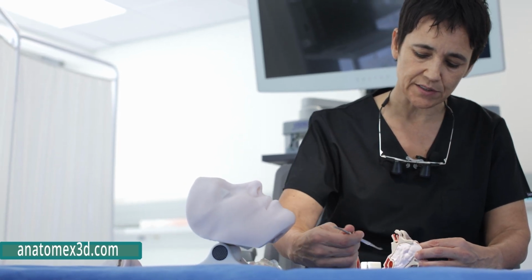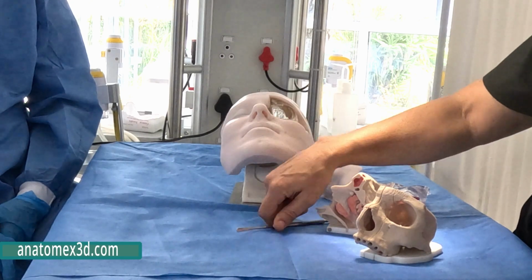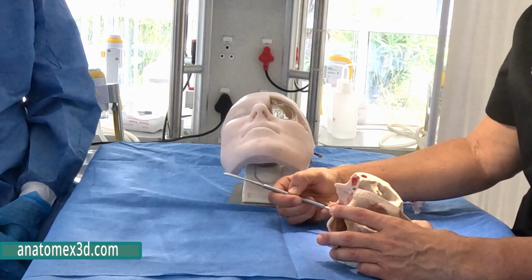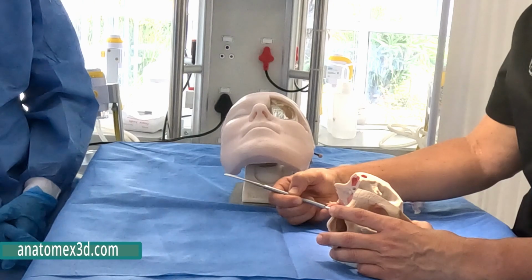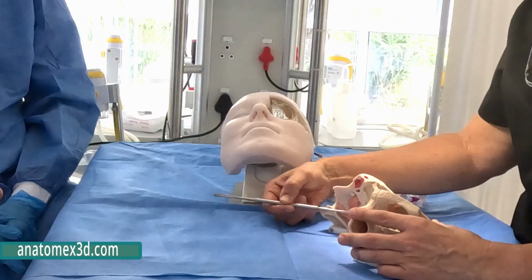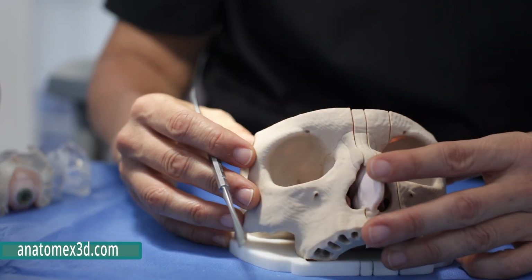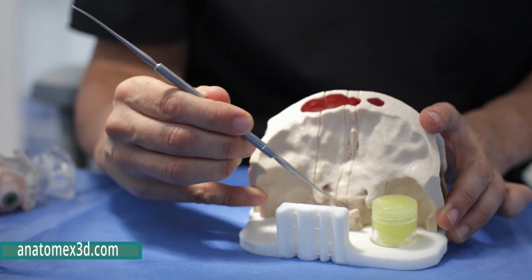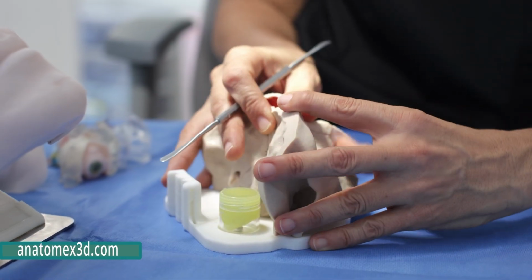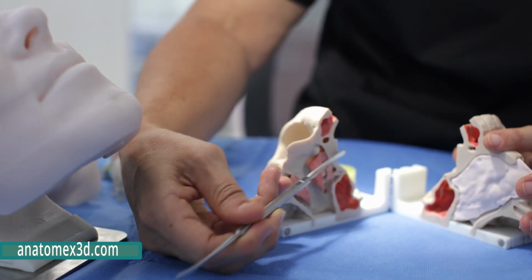Then we have a very big sinus in the middle of our head. If you draw a line between your ears and through the center of your head, where those 2 lines meet will be your sphenoid sinus. This is a very important sinus for us to access when we do certain surgeries and brain surgeries like pituitary surgery. We need to go through the sinus and through the back wall to get to the pituitary fossa. If I take this model and turn it around, this would be our pituitary fossa. So we go through that sinus, and as we exit the back wall, we find our way to the pituitary fossa to remove that brain tumor.